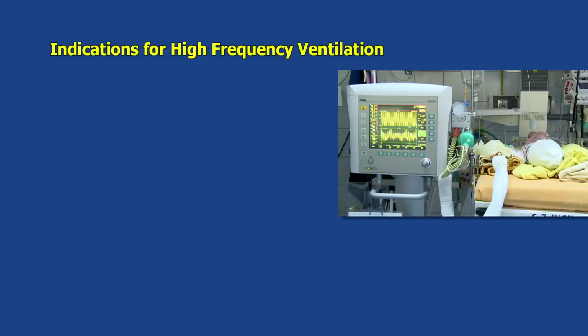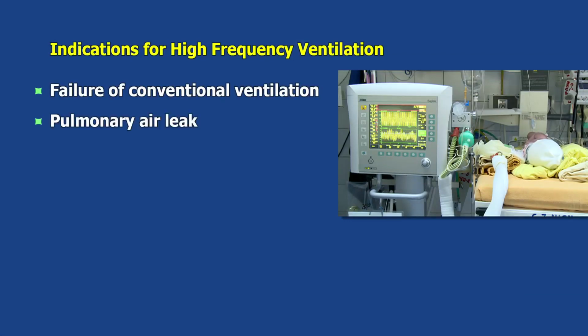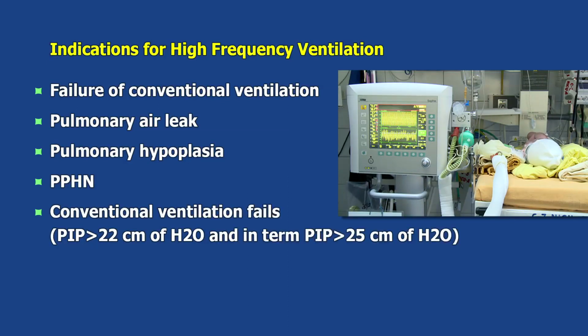The indications include failure of conventional ventilation, pulmonary air leak, pulmonary hypoplasia, and PPHN.